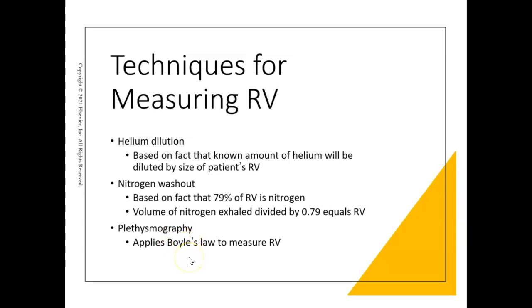But plethysmography requires a patient to sit inside a closed box and perform a maneuver where they have to keep their mouth tightly sealed around a mouthpiece. This maneuver, when you guys get to have this done on you when we go to the PFT lab, it's difficult to do it right.